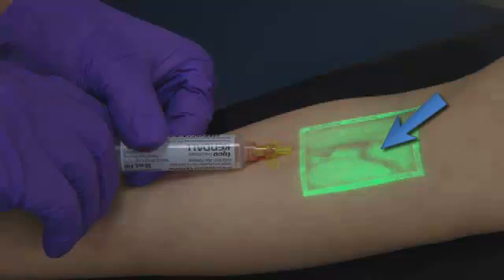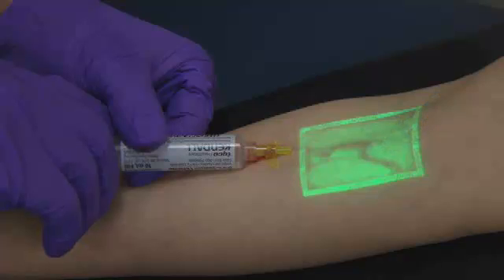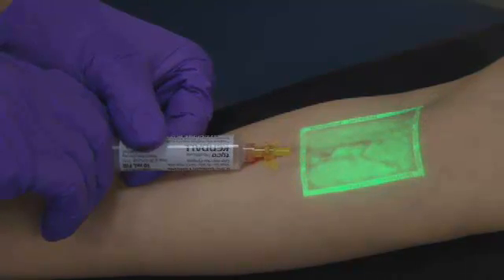Observe the flushing of saline through a patent IV. Only VeinViewer's digital image allows you to see this directly on the surface of the skin.